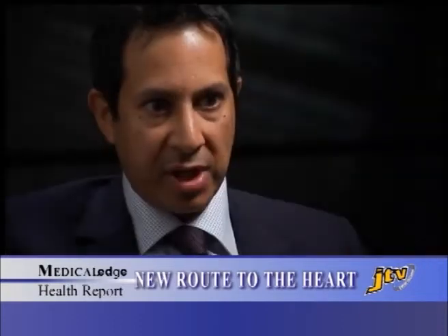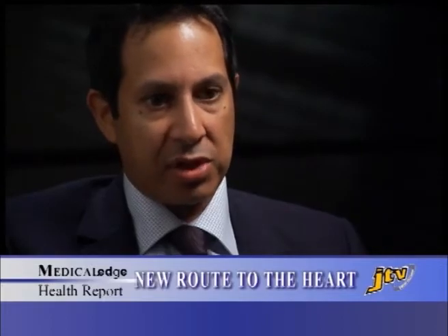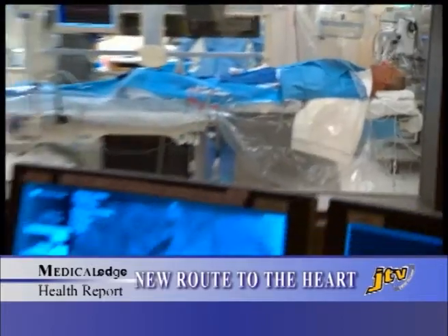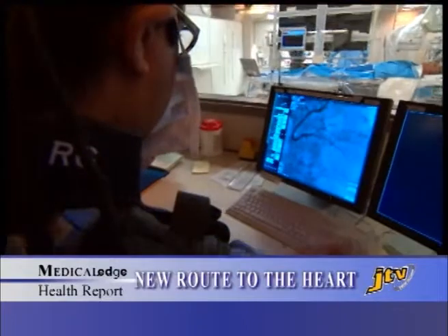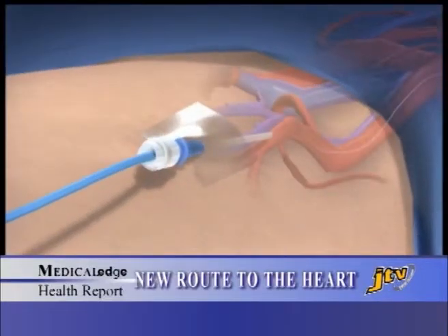There have been a number of studies now that have compared femoral versus radial access, and every single study shows a lower bleeding risk. Plus, there's often less discomfort, and patients can go home the same day and get back to normal activities. Now, here's how the two procedures compare.